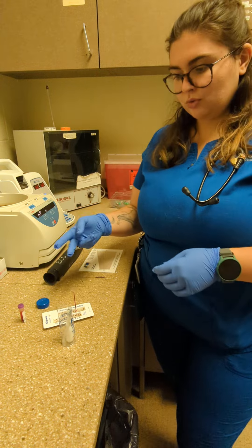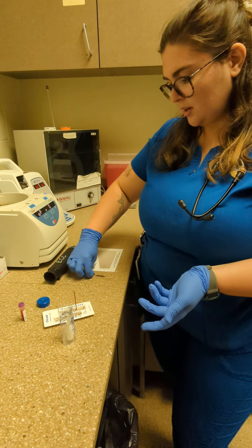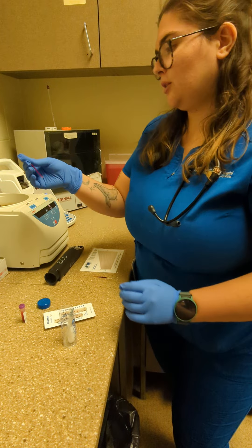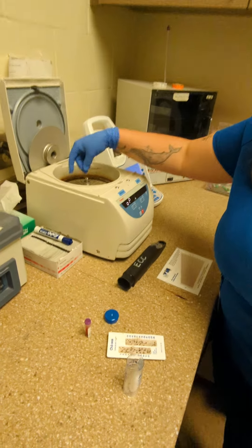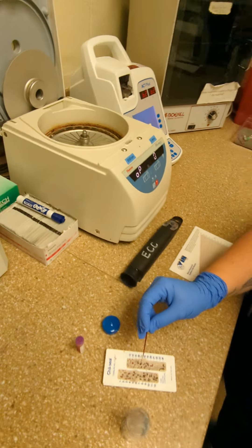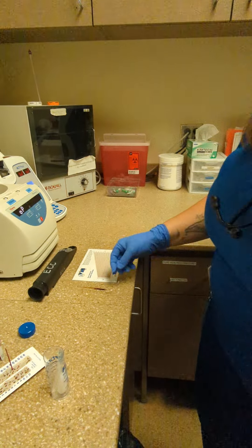You usually make two to keep your centrifuge even — I already spun some to show. Once you get your blood filled up, put both of them in your centrifuge equally apart, put the lid on, and it spins for five minutes.